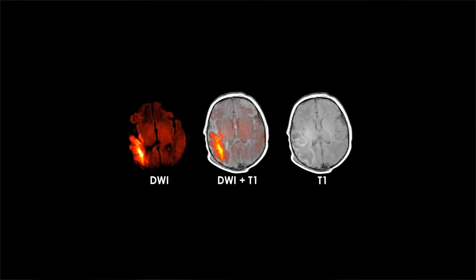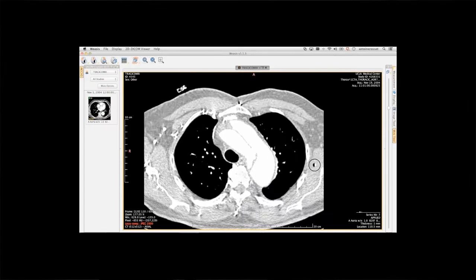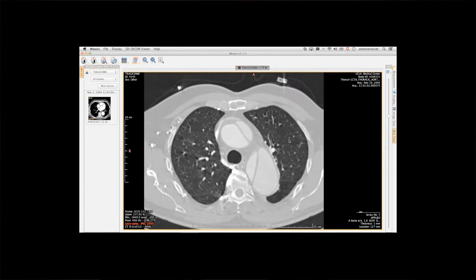The PET, they inject a radioactive tracer, a very small amount. It's virtually nothing. Sounds a little scary, but it's really not dangerous at all. This radioactive tracer is actually attached to a sugar molecule. Your tumors are thirsty for sugar. They're growing quickly. That's one of the hallmarks of them in most cases.